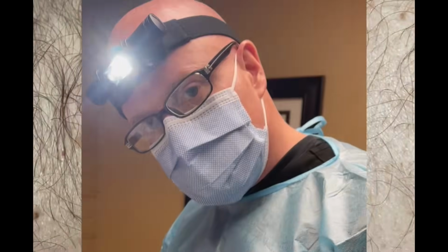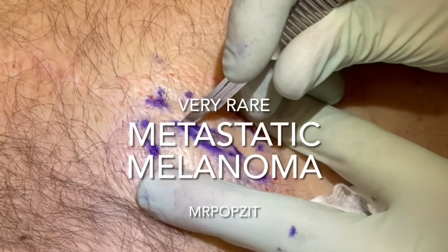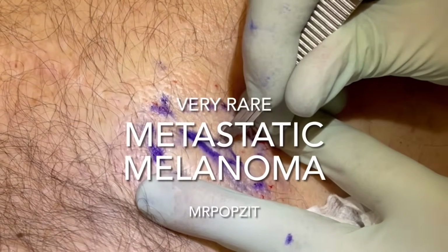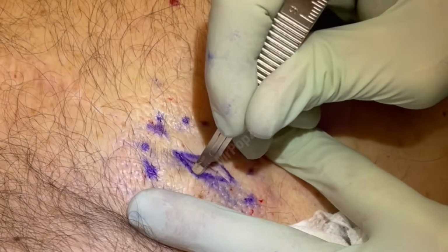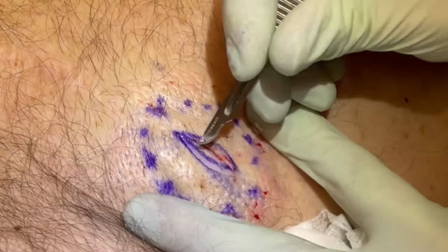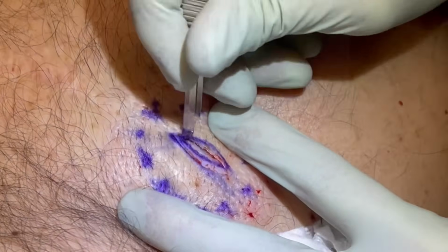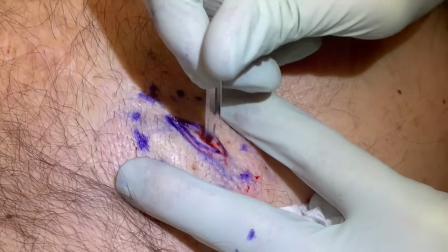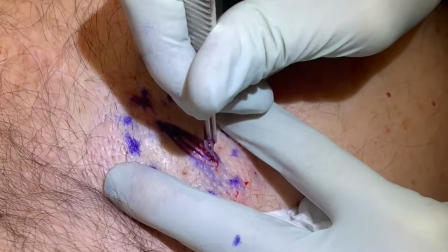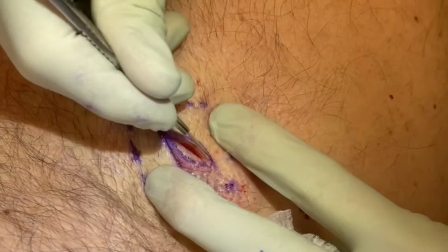Okay, guys, here we go. We have the cyst numbed up here. We're going to do a little elliptical cut, so we have a little small handle here to take this out. I do that also because generally there's a pore at the surface and it gets that as well. Well, this is a very firm one. We'll see if it's under pressure once we get down here. Commonly for males, the back skin is very thick too.